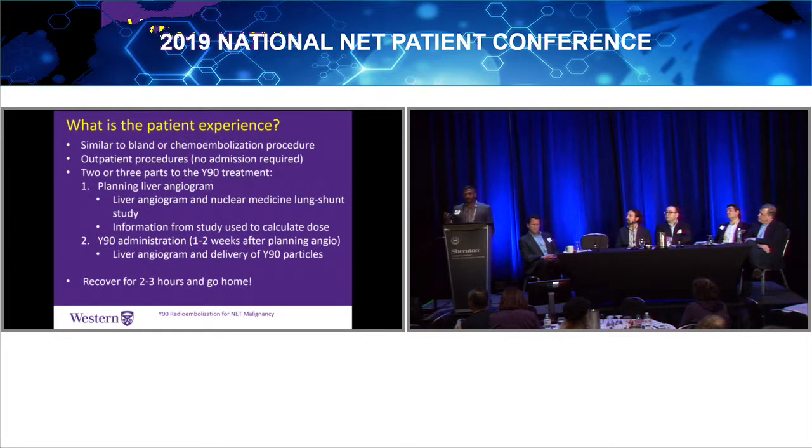What's the patient experience with Y90? Well, it's pretty similar, but the only difference is that it's really an outpatient procedure. And it involves two separate procedures. We do a planning day where you bring someone in, do an angiogram of the liver, and really map out the blood supply of the tumor.